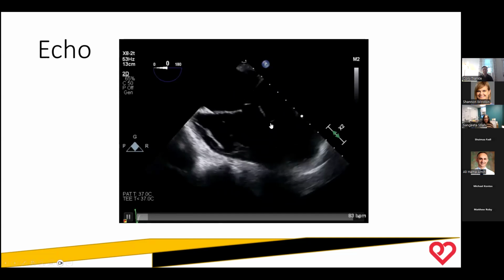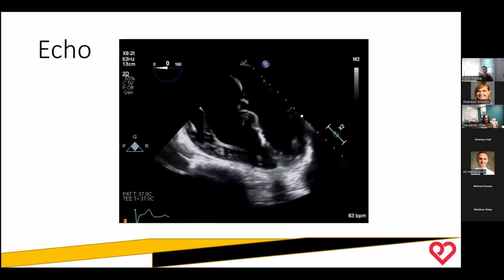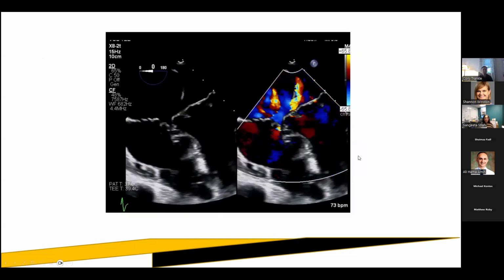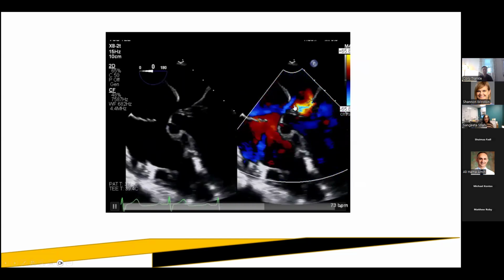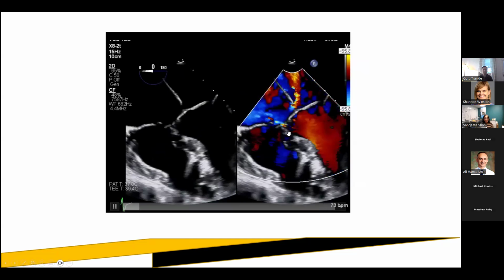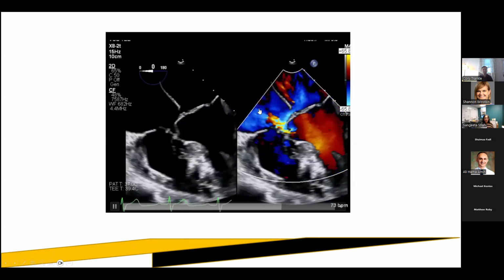I'm also going to show you someone who's been repaired and what we need to look at by cardiac MRI. Here's another picture. Here's a color confusion, but it's gorgeous. Here is your ASD jet, a left to right shunt. Here is regurgitation that's going from the underbelly of the LV side straight into the right atrium.